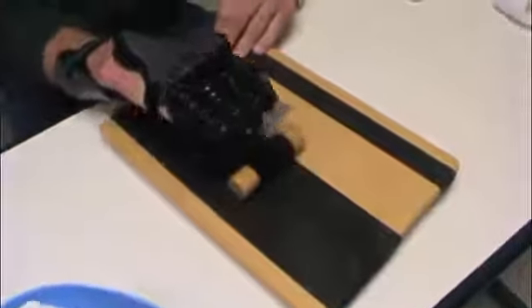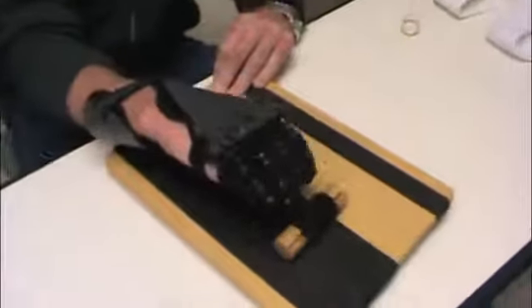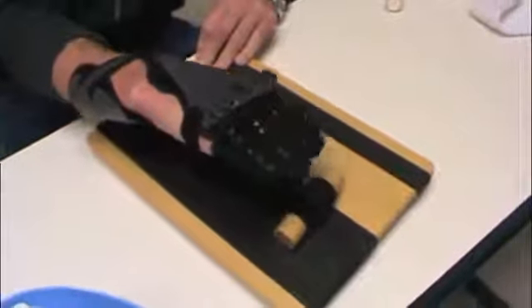With the SABO Glove on, finger extension is now evident following grasping. Also with the help of the finger tensioners, the Velcro dowel activity is now successful. This allows the client to properly train the weakened extensors which was not possible without the SABO Glove.